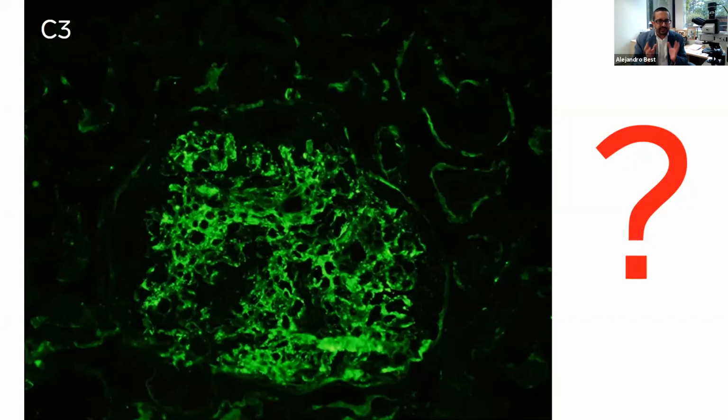As part of the exercise that we're doing, this picture that you're seeing is the same picture we're going to show you in every single case we'll present. Obviously, it doesn't belong to every single case, but it's just to send the message that they can look identical, and that's why you need the other modalities to reach a diagnosis.